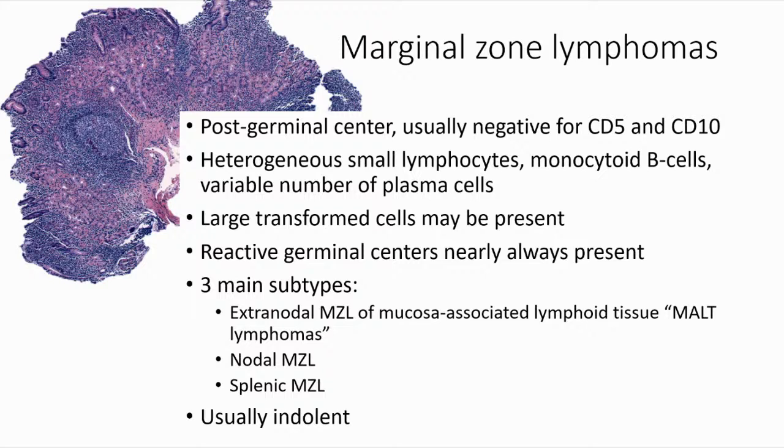Well, here at the clinic, we actually have a little small B cell panel. And I think that has the range of things that you'd want to do, like CD3, CD20, cyclin D1, Ki-67, CD21 to look at the meshworks. And then often would add a kappa lambda onto that. More recently, we have added that dual kappa lambda ultrasensitive stain, which I don't do in every case.